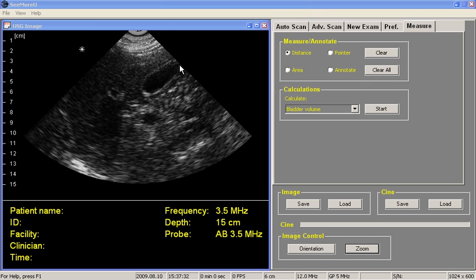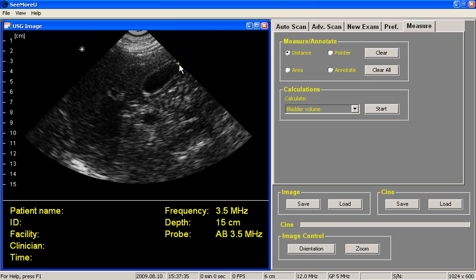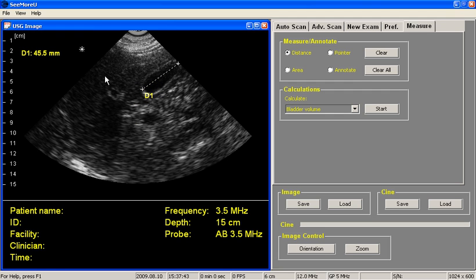We move our arrow to the region we want to measure, we right-click, and while we hold the button down, we drag to the other boundary, release the button, and we get our first measurement. And we can measure as many distances as we like.